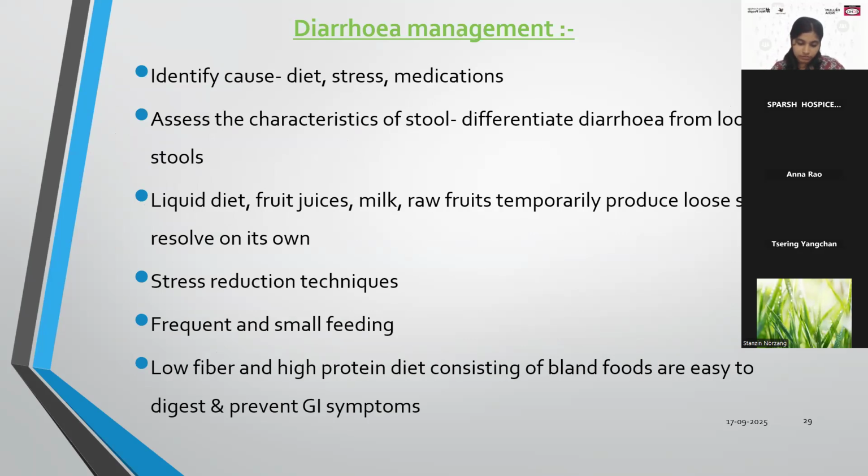For ileostomy, a one-piece drainable pouch is available, which can be changed every 1 to 3 days based on the need. For a two-piece drainable pouch, the base plate should be changed twice or thrice a week as per the need, because slowly the gum will go off and the wafer plate will come off. And the pouch should be changed every 1 to 3 days. It will depend on how frequently the patient is getting the stools.